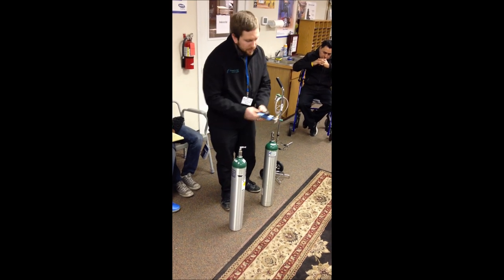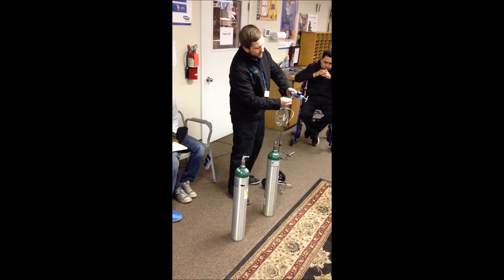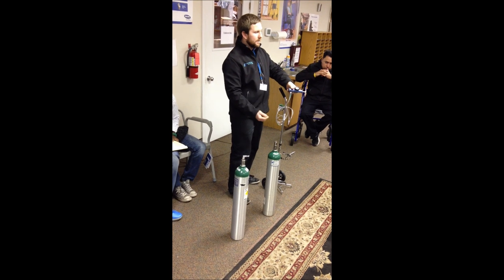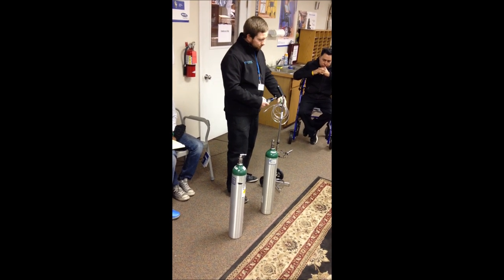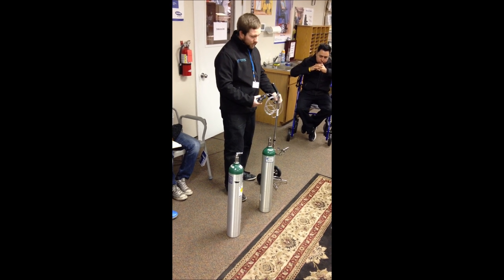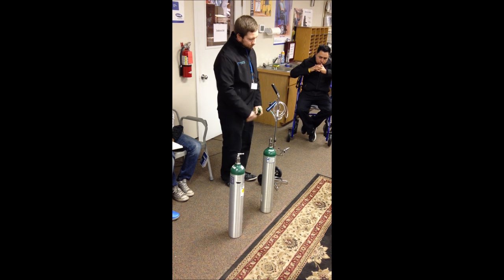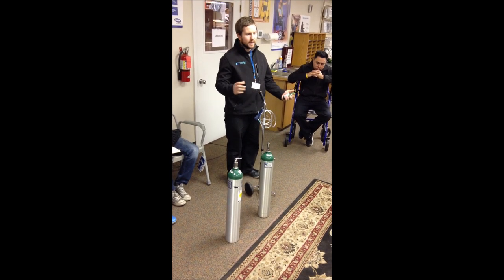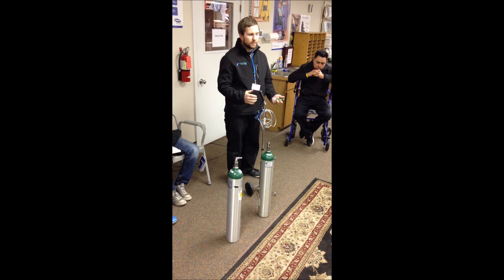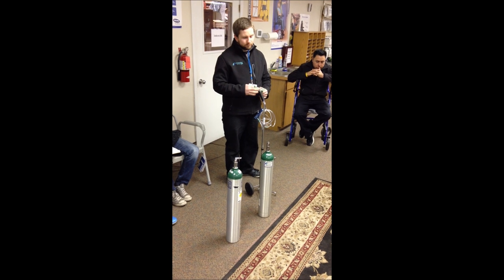One thing not yet shown is where your cannula or tubing goes — it connects right onto the bottom of the regulator. A lot of folks just use that seven-foot cannula, which can reach from the regulator to yourself. You also have a cart you can carry it in. One thing a lot of people don't know: you can't actually use these on public transportation unless the tank is attached to something like an E-tank bag or a wheelchair.